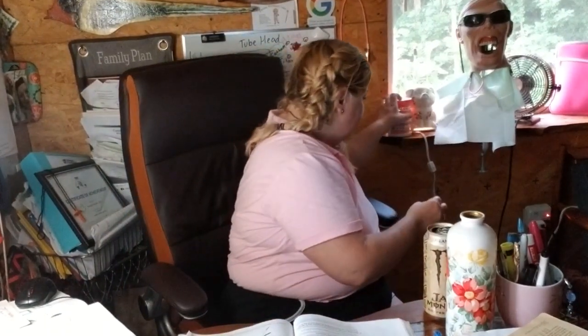Now, I don't want to get you confused, but I want you to remember this, okay? When you're taking x-rays, remember, brackets will show up what? Radiopaque, okay? If you have to get further back, say they have their wisdom teeth, they're keeping their wisdom teeth, and maybe you're going to be doing a crown on a wisdom tooth. Some do, okay? What you're going to do is you can always take that sticky tab and move it, or position it further back. So you may want to have a little bit hanging out like that so you can get way back there. Especially sometimes you have to take an x-ray of a tooth that's not there. Go further back like that.